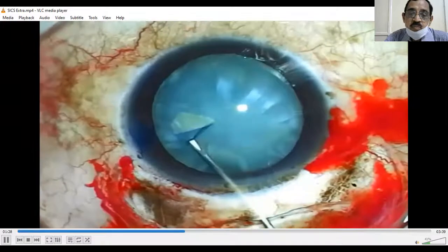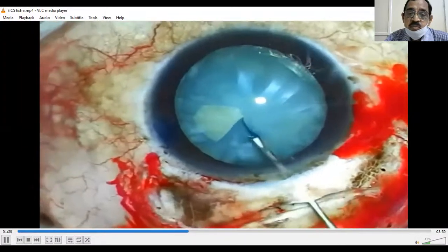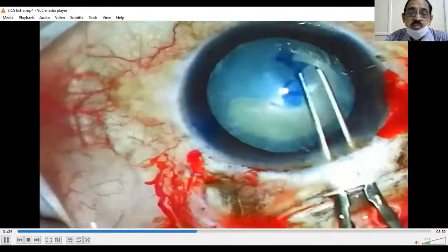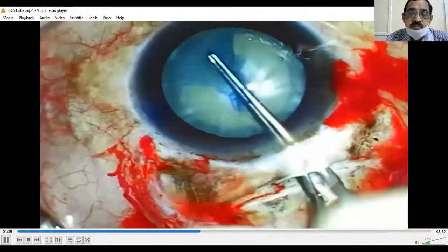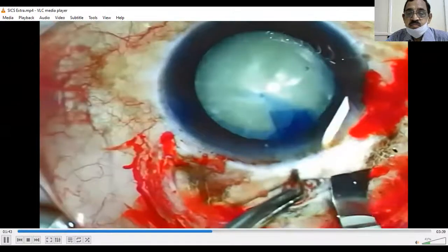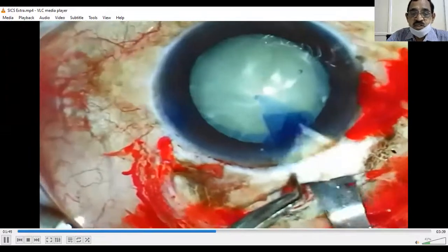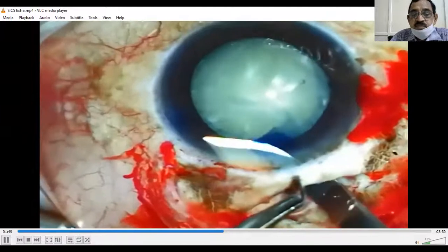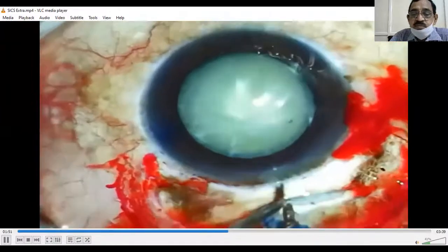A cystotome is then used to begin the capsulorhexis. This can be done either as a continuous curvilinear capsulorhexis, as is shown here, or as a can opener technique. It's important to ensure that this capsulorhexis is relatively large compared to those that we use for phacoemulsification. And then the incision is enlarged again with the keratome blade. You can see how pronounced that internal opening is relative to the external.